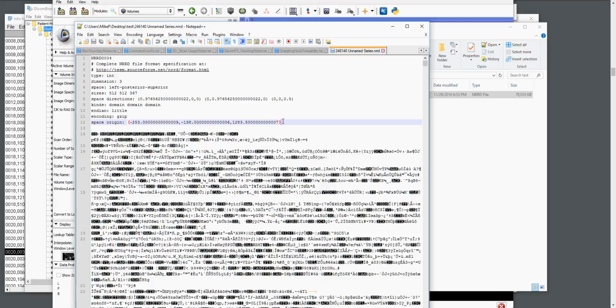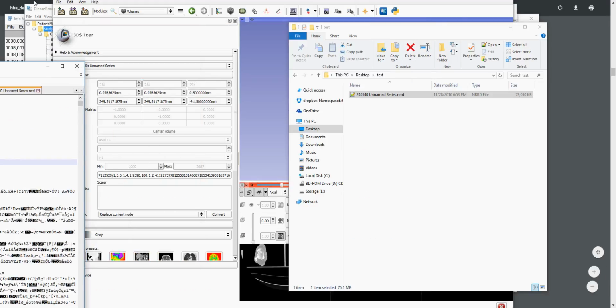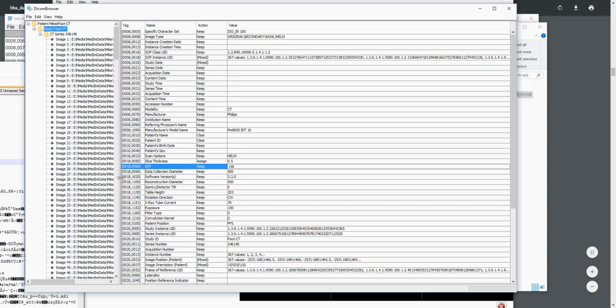What this doesn't have is things like, is it an MRI or a CT scan, or is it a 3 Tesla or a 1.5 Tesla MRI scan, and various other information that you can get if you still have your original Dicom data. So it's one reason that it may be more helpful to send anonymized Dicom data versus an NRRD file, which is anonymized.